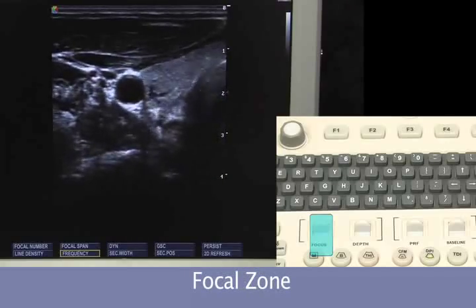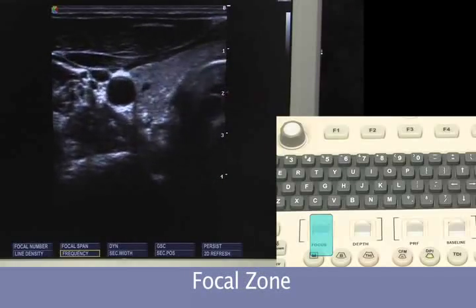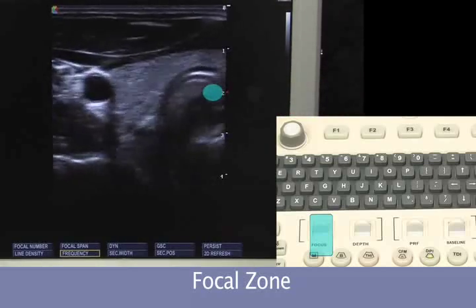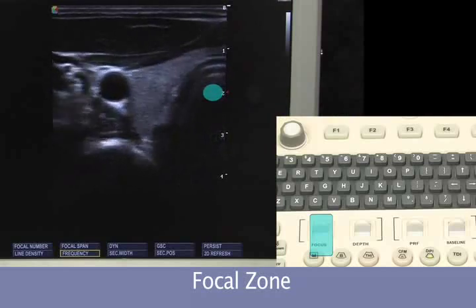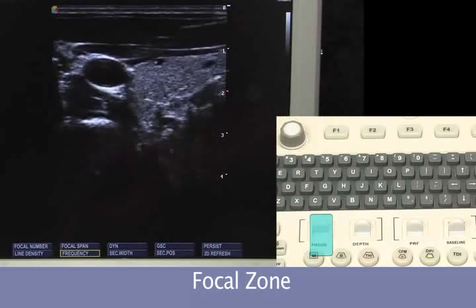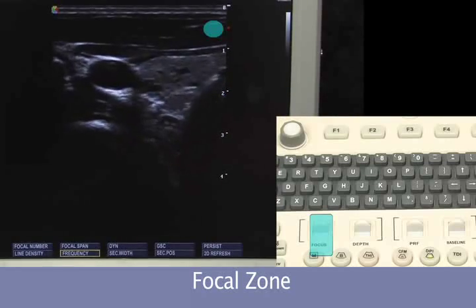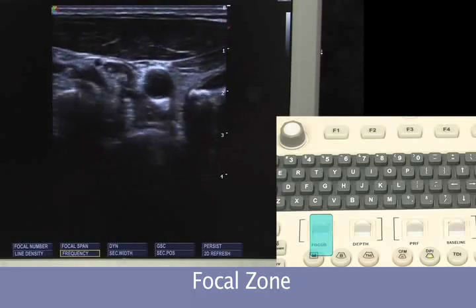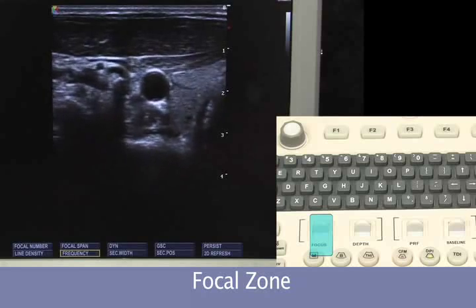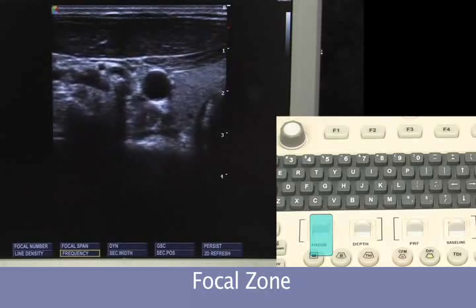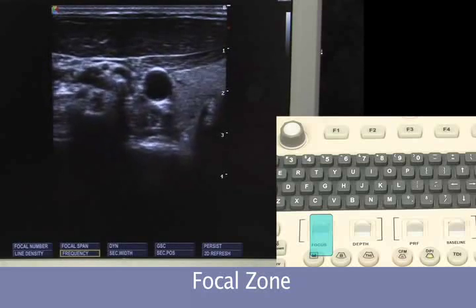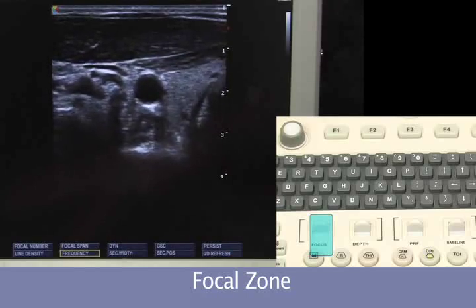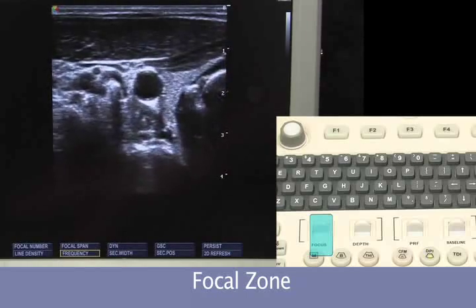Now we will look at adjusting our focal zone. The focal zone on transmit is displayed by the red caret on the right side of the screen, and should be placed at the level of optimal interest. Taking the focus up to focus on the near field dramatically improves detail. However, moving the focal zone to the very near field will compromise our far field. What we would like is the focal zone at the highest area of interest, or just below it.